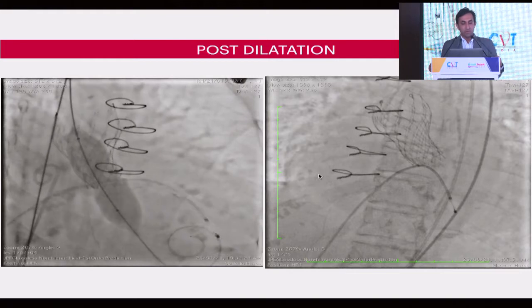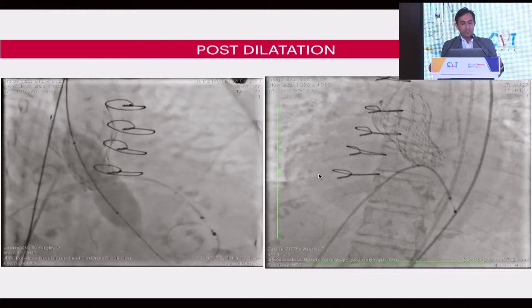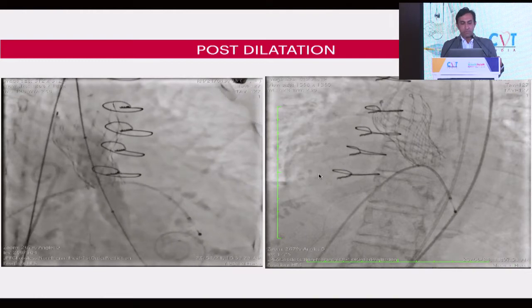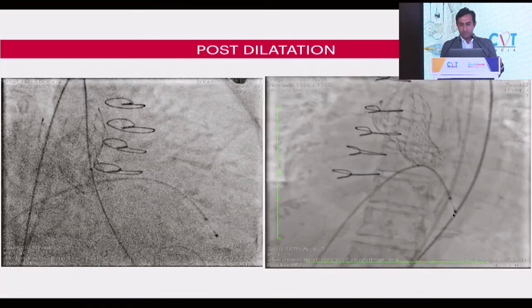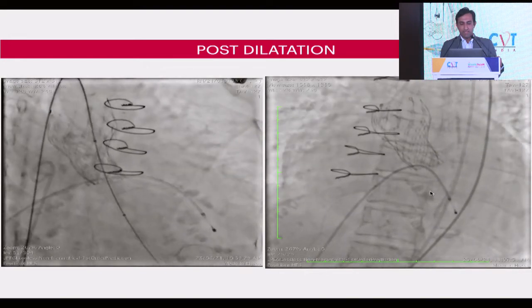So pace at 180 to 200, and then inflate with the 20 millimeter balloon. And this is the final angiogram.